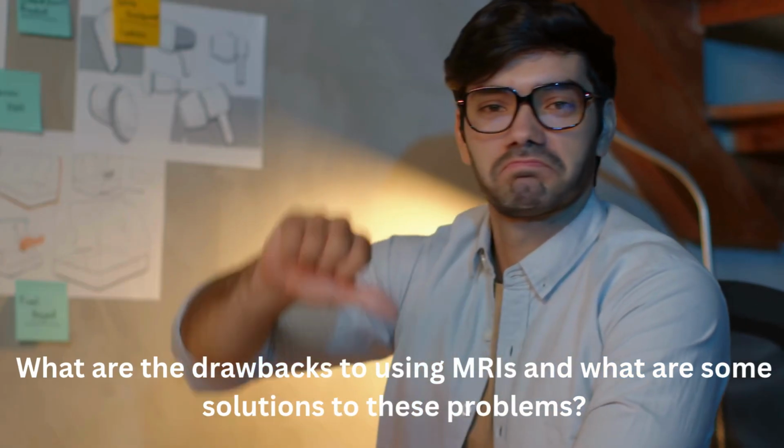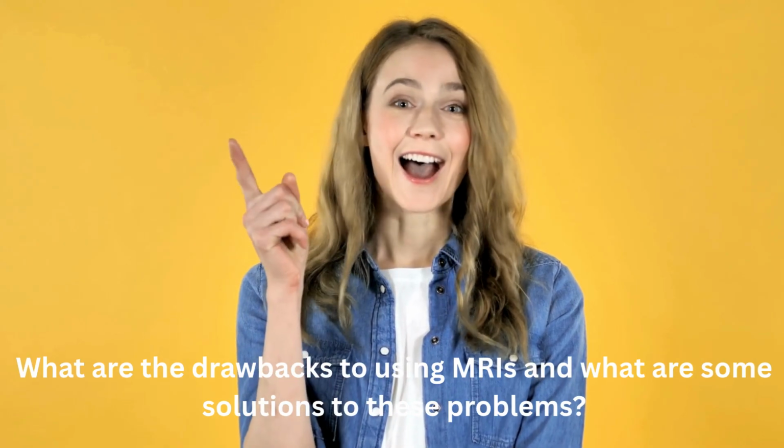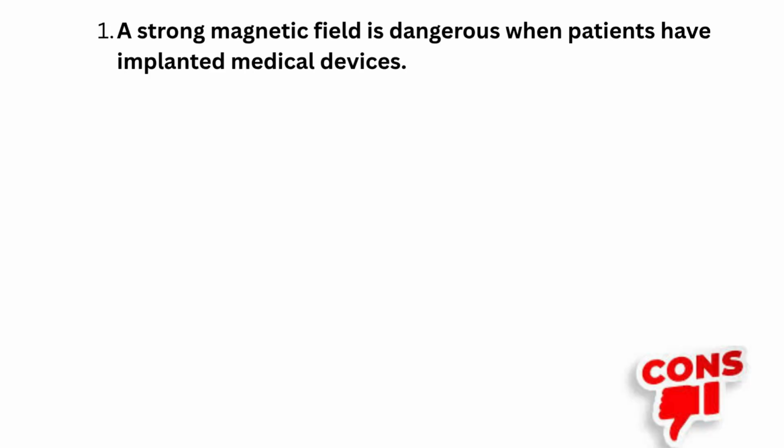What are the drawbacks to using MRIs? And what are some solutions to these problems? A strong magnetic field is dangerous when patients have implanted medical devices. Medical devices may malfunction or distort the image. To avoid this, a thorough screening questionnaire before MRI is necessary, though some can be scanned under strict conditions. Otherwise, alternative imaging such as CT scans are available.